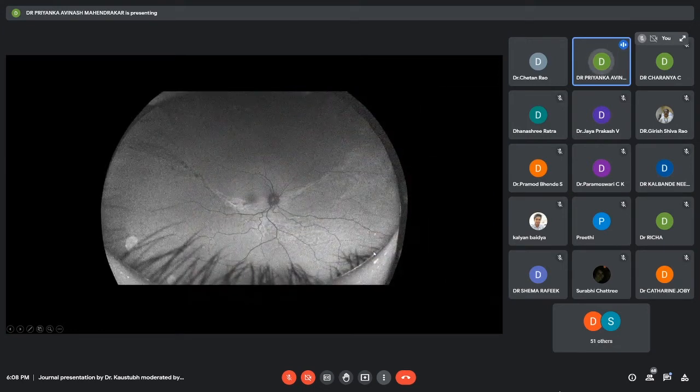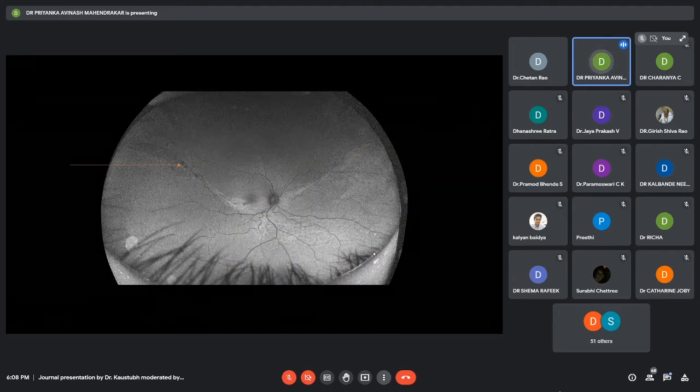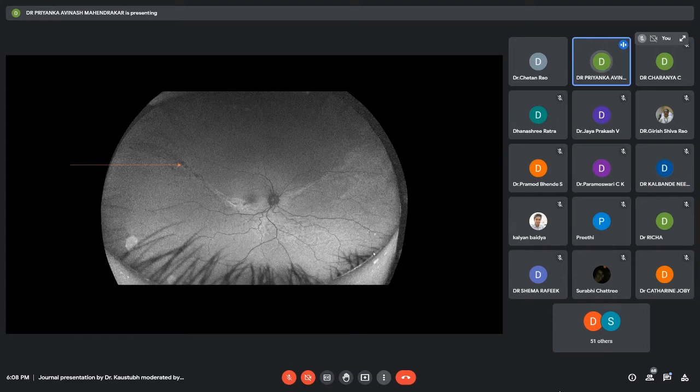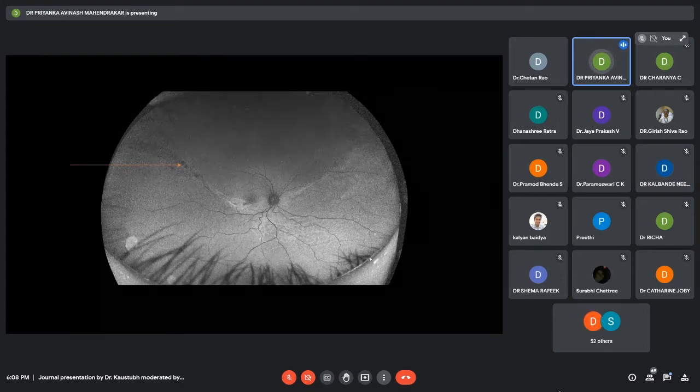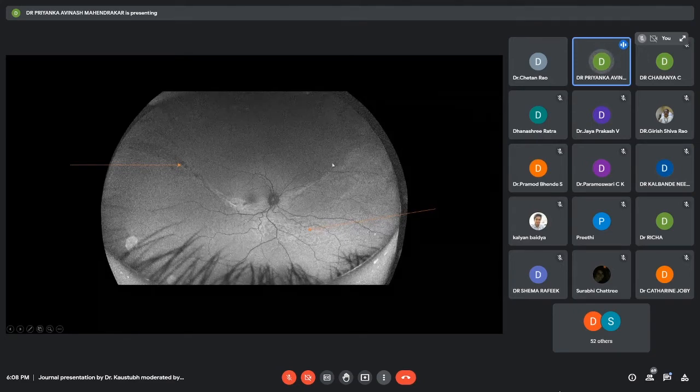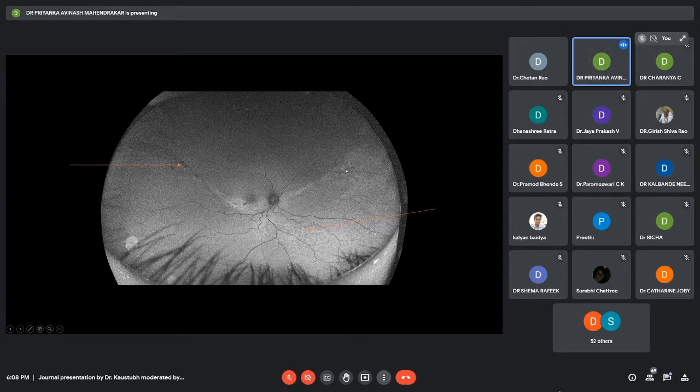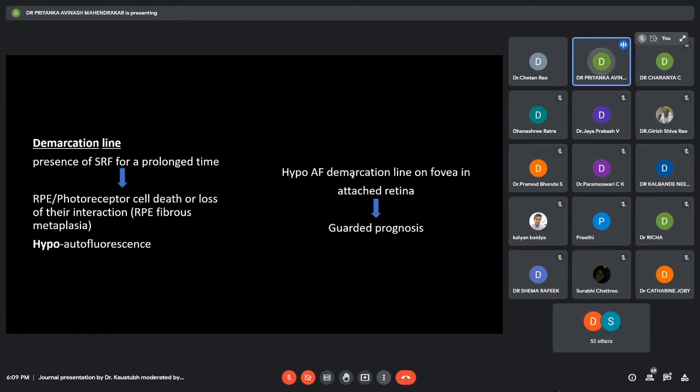The autofluorescence image again showed the demarcation line which had hypo-autofluorescent, clear hypo-autofluorescent spots and the subretinal gliosis. Also, here we can see the attached and detached retina, we can see the demarcation between the two because of this autofluorescence findings. Now, why is there a demarcation line? When there is presence of SRF for a prolonged time, it leads to RPE or photoreceptor death because of the loss of their interaction. There is basically RPE fibrous metaplasia which gives us some hypo-autofluorescence.